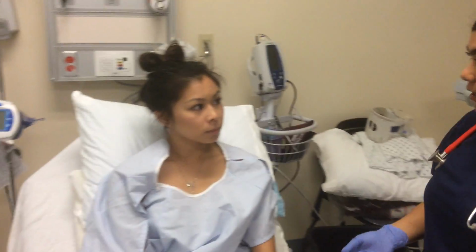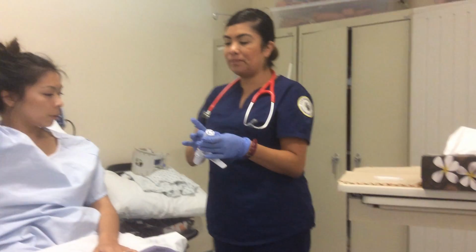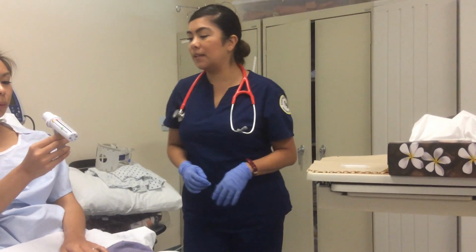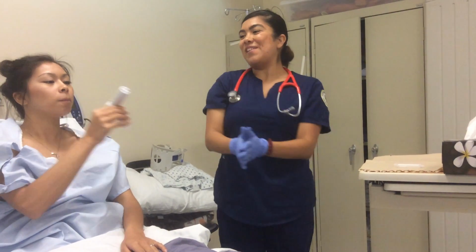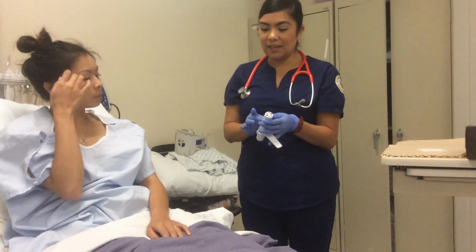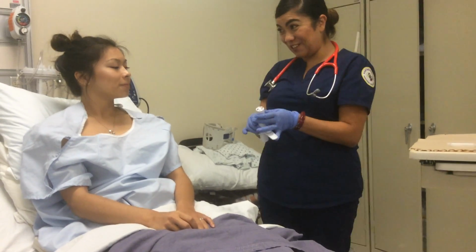So right now you are at 375. Remember, it's going to be the best out of 3. So we want to try to get to our goal, and it's at 375 right now. Okay. And boom. Very good. There we go. See, there we go. So now we're at 410. Okay. Now this is the last one. This is the good one. This is where you're going to get your goal, right?